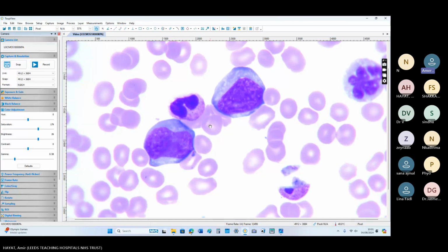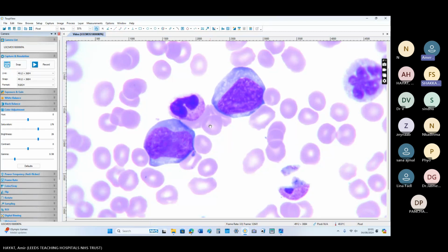And the presentation of the patient is usually different in Burkitt. Burkitt has one mass in the body area. They do not give you a disseminated lymphadenopathy usually. Whenever there is a presentation of Burkitt lymphoma, you will see a mass at a local area, and that's it. This patient has widespread lymphadenopathy. Some of the cells have vacuolation, some do not. Very large cells, you can compare the size with the RBC. Some of them are vacuolated, others are not.